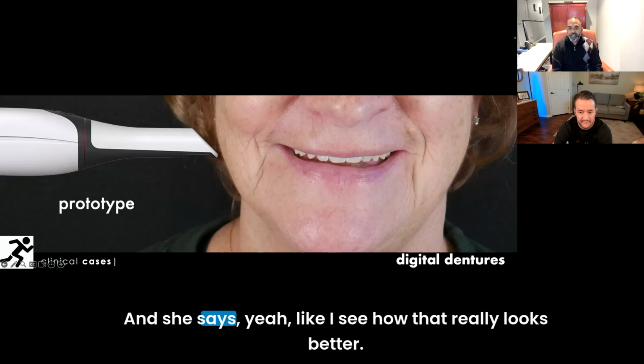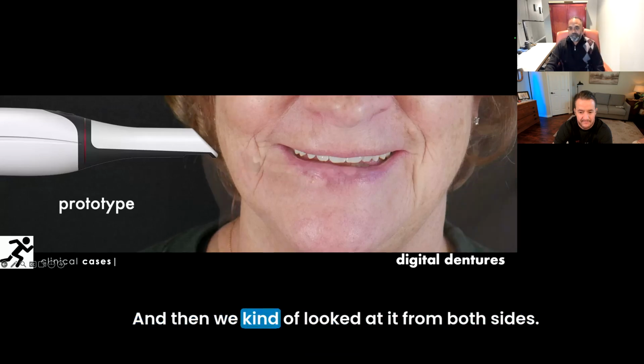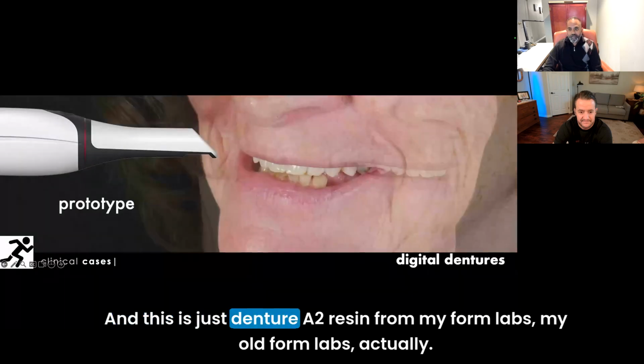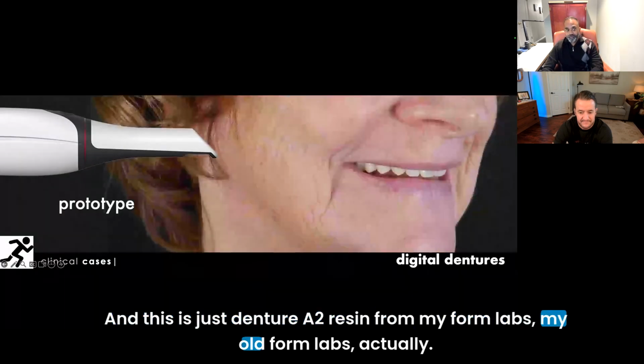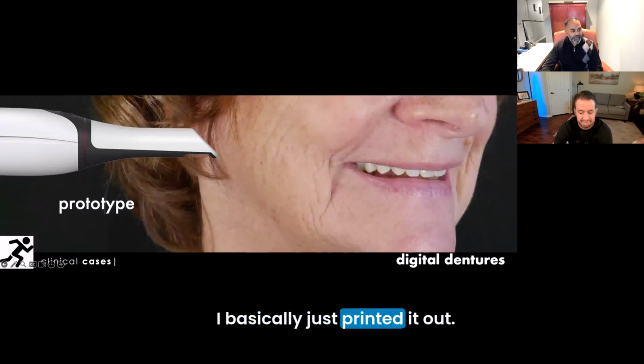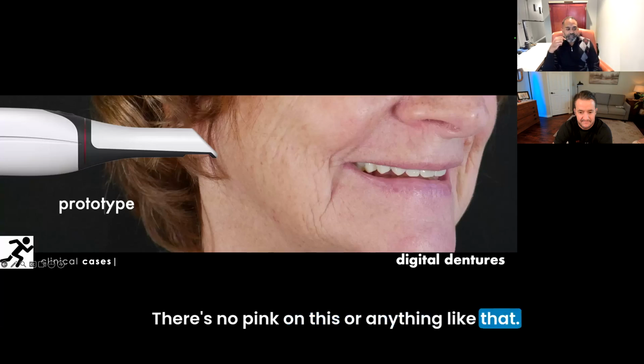She saw that, and she says, oh yeah, I see how that really looks better. And then we looked at it from both sides, and this is just Denture A2 resin from my old Form Labs. So this is not an expensive printer. I basically just printed it out. I painted it with glaze. There's no pink on this or anything like that.